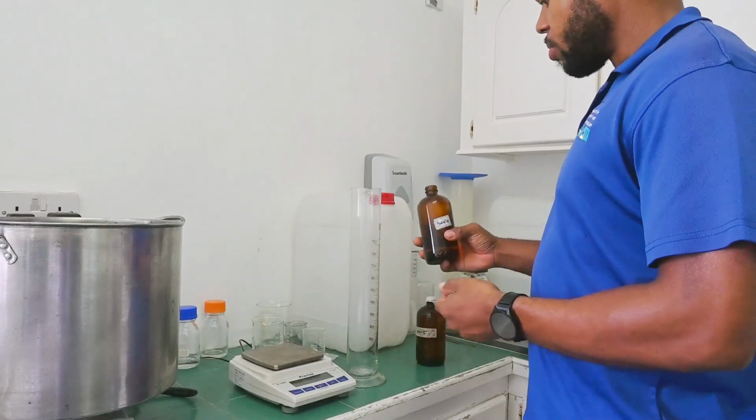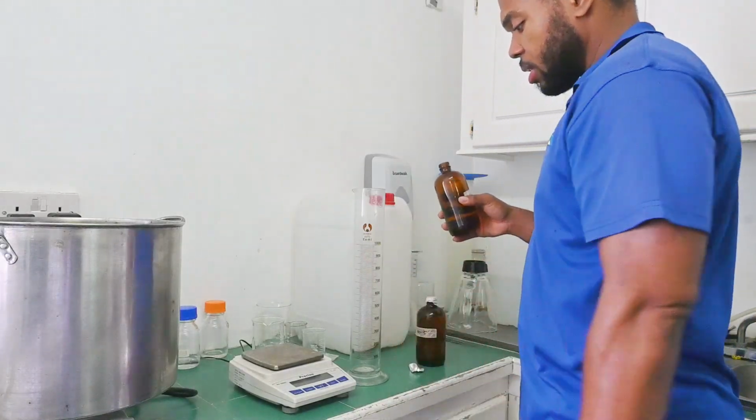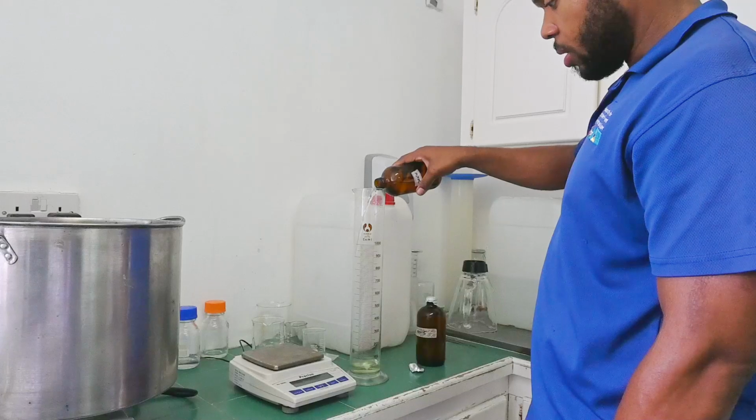Next stock solution we're going to add is MS5, that's the iron stock solution. This one is 20 milliliters per liter. So we're going to add a total of 320.